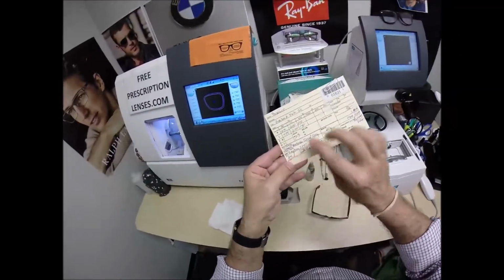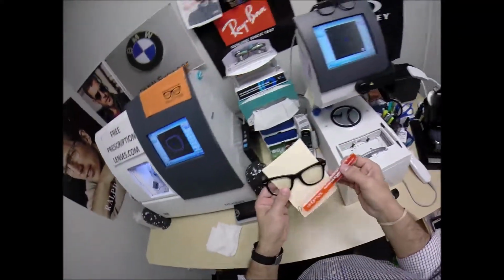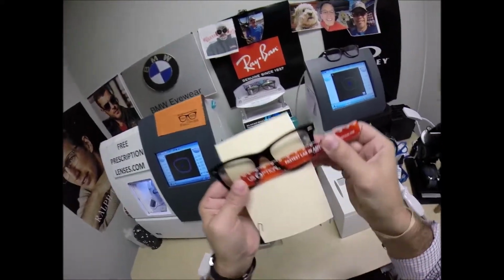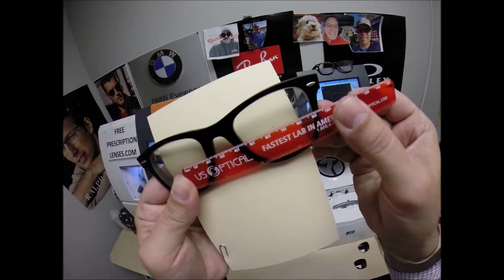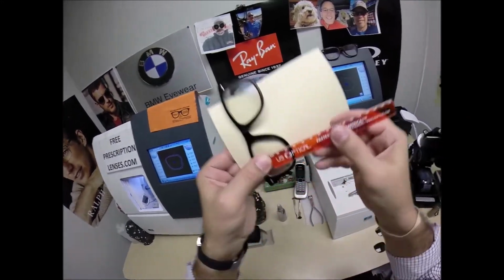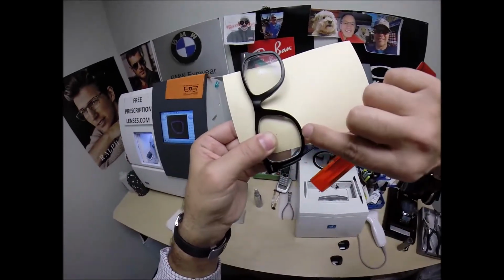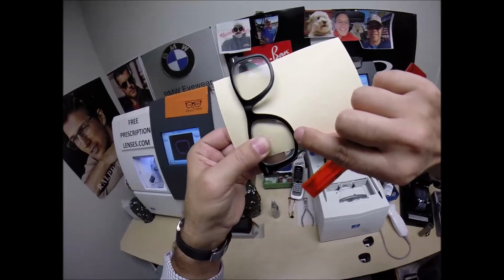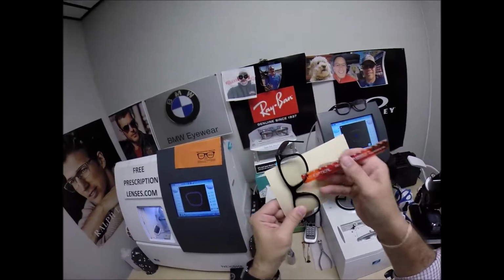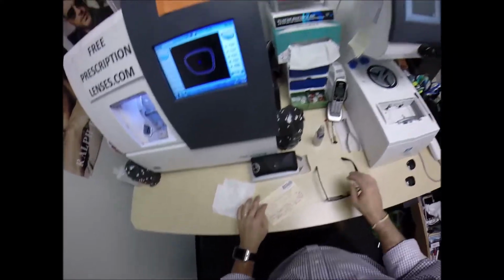So your pupillary distance is 64. Turn the card around, place the PD stick. Where's my, oh, it's in my pocket. That's why I can't find it. Place the PD stick against my thumb on your right lens. When we hold it up to the left lens, we're getting 64 millimeters, so that is cut perfectly. Let's check the optical center height of 23. When you look at the middle of the bottom of the frame, not the bottom of the lens, remember the bevel goes down. The lens actually goes down into the middle of the frame. We're getting 23 millimeters there. Man, that kit is good.